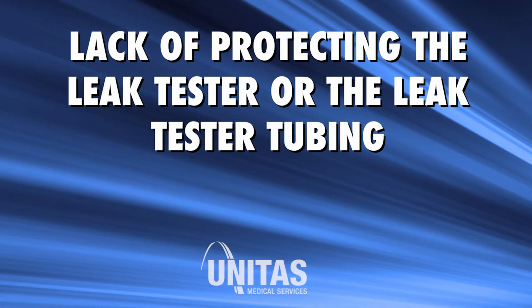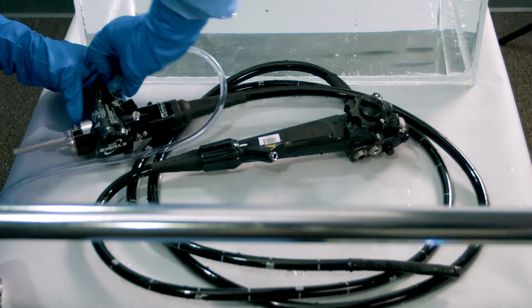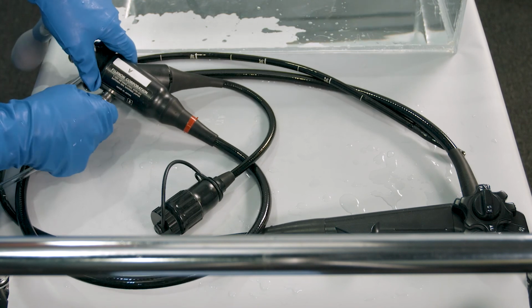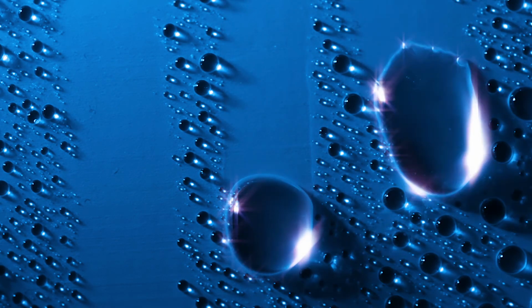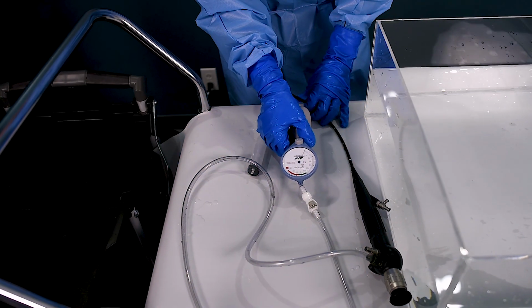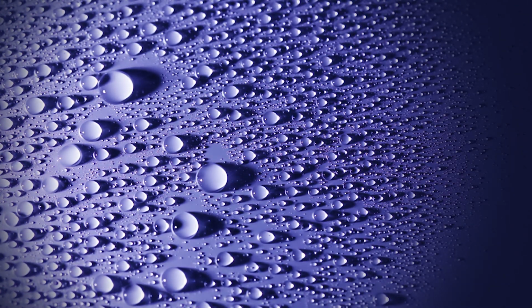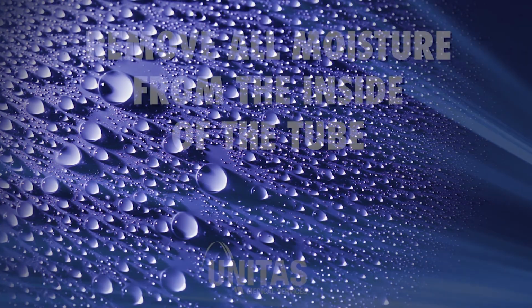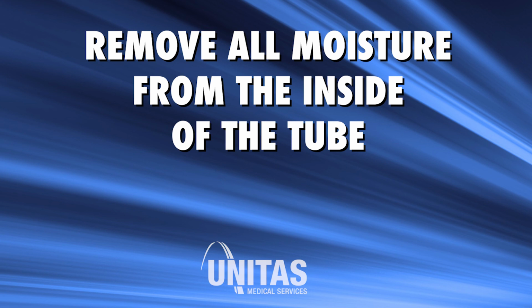Lack of protecting the leak tester or the leak tester tubing. All leak test tubing, regardless of leak tester type, needs special care to not get fluid inside the tubing or tubing connector. Fluid inside these areas, if not removed, will cause water to be blown into the endoscope on the next test. If using a handheld leak tester, it will be very important to not allow the leak tester body or both to fall into the fluid. This will result in fluid invasion. If the end of the tubing accidentally falls into the sink, make sure to blow out or run the tester air until all moisture is removed and the tubing is internally dry.